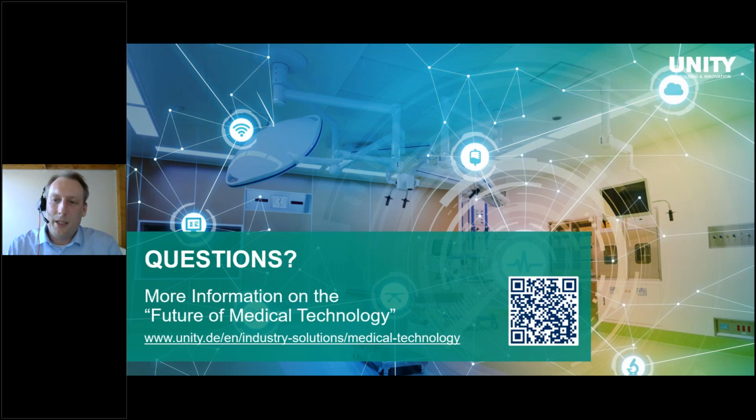There's another question related to this topic: would device A always need to be a medical device, or could it also be a software application such as an EMR or data analytics program? I think from the intended use case that I described, and I'm of course not the regulatory affairs guy, but from what I know about this topic, device A would need to be a medical device, as it's directly involved in the patient care, has live data, and displays alarms for a medical purpose. So it qualifies as a medical device.